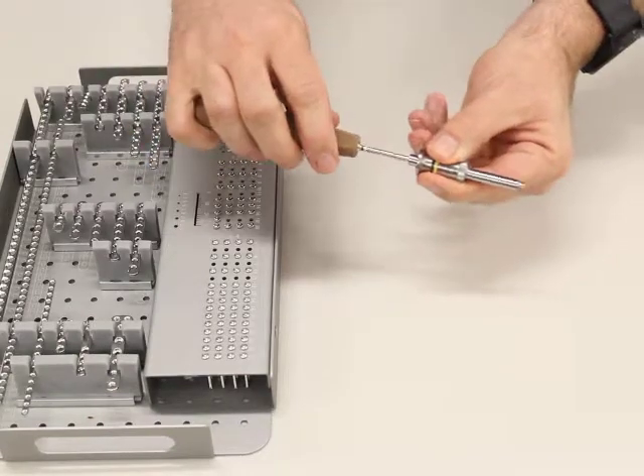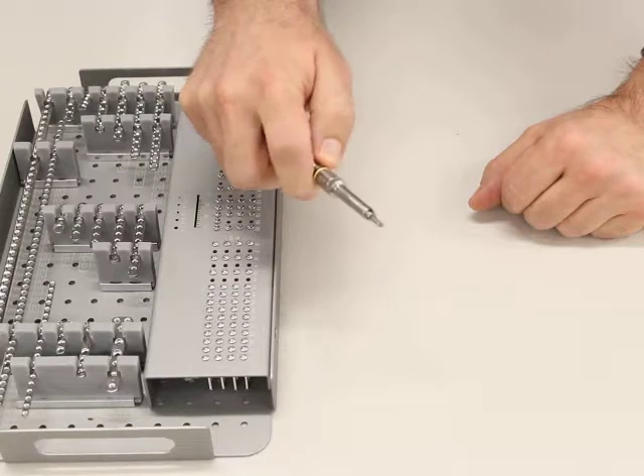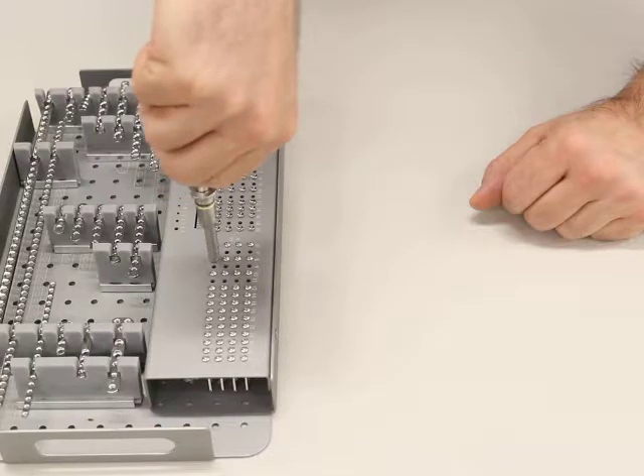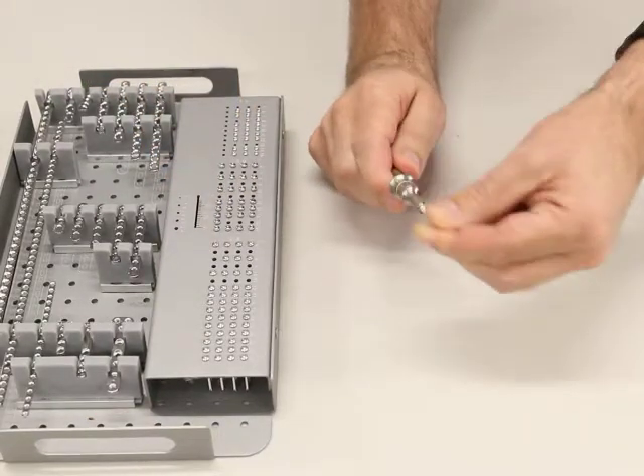You just pop it on like this — it just pops on. Then pick up a screw: you pull back, insert the driver into the screw, push that down, and it's now held extremely securely — it doesn't move.